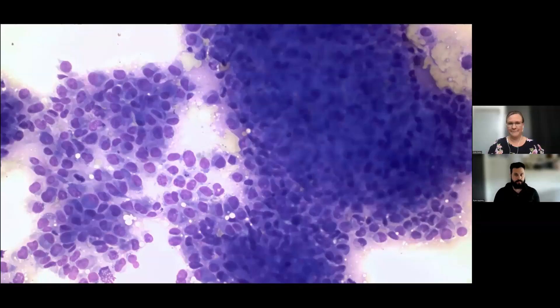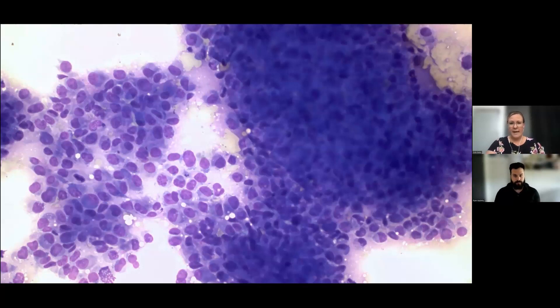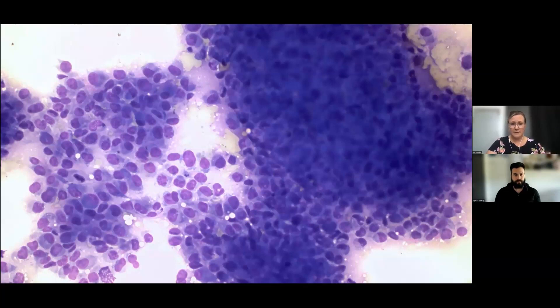Looking at the cytology sample from this bone aspirate, the first thing to note is that this is really cellular. Bone should not exfoliate normally — if you stick a needle into normal bone it won't give you many cells; maybe low numbers of osteoblasts or an osteoclast. So the high cellularity is already very abnormal. In cytology we like to look at multiple objectives — starting farther back and then honing in for more detail.